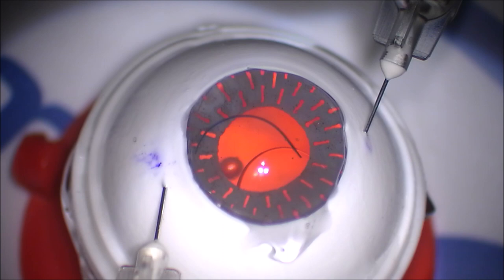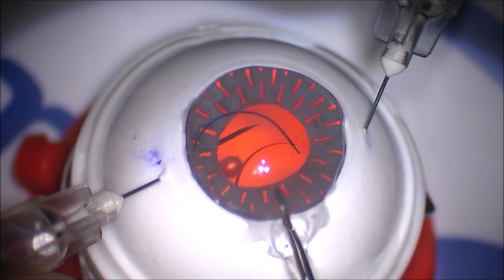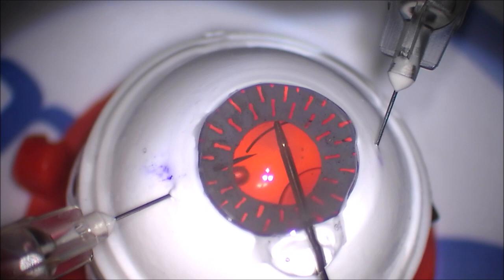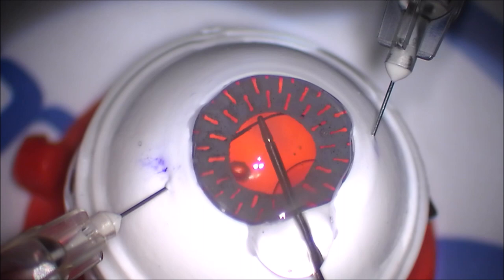So I go ahead and grab the leading haptic with the forceps. I'm turning the needle so the bevel is up, so the haptic is approaching the bevel of the needle. You can see it goes in very, very nicely.